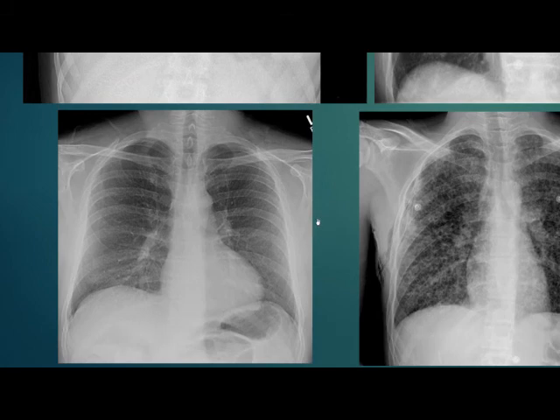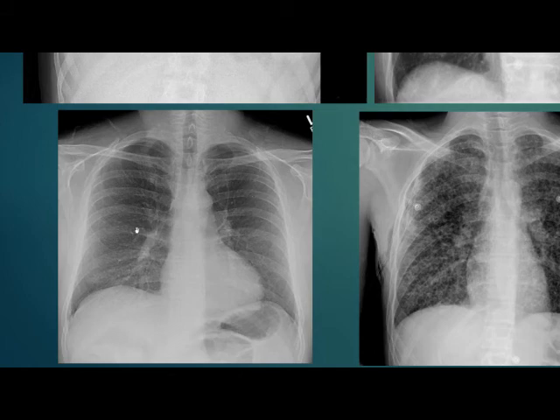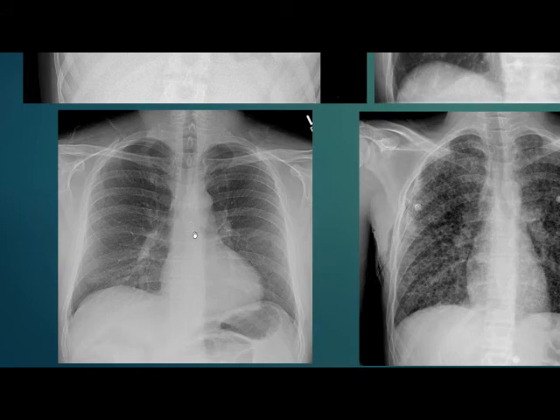In this next image, there are subtle nodules visible, along with fine reticulation. There is also slight sparing of the costophrenic angles and apices. This is a case of hypersensitivity pneumonitis.